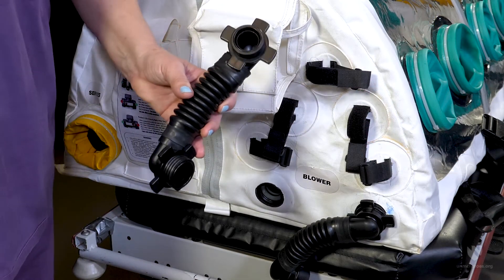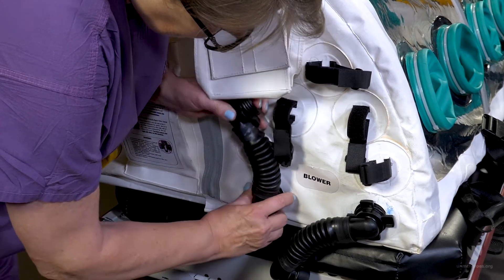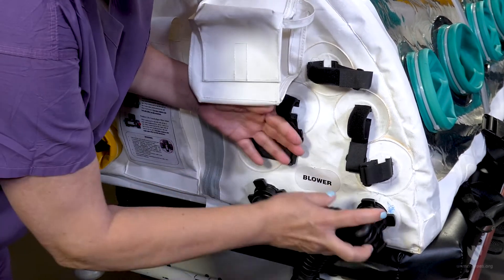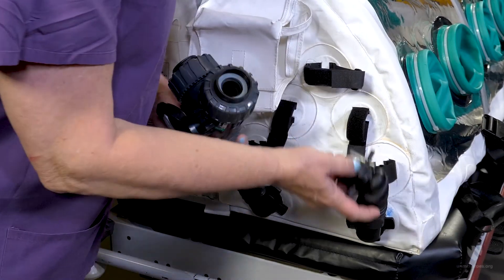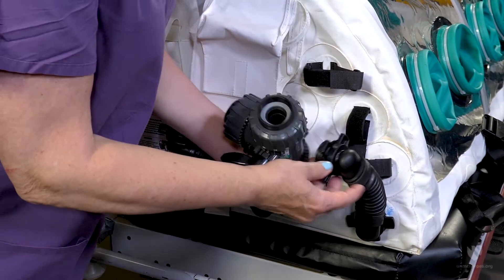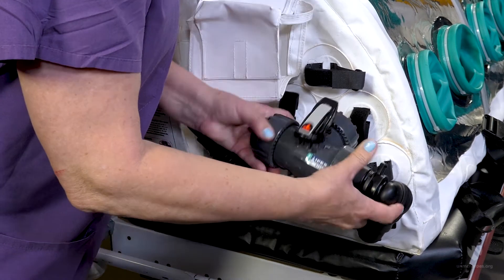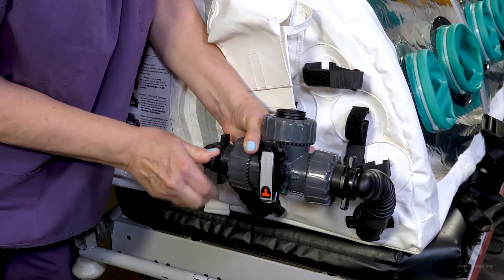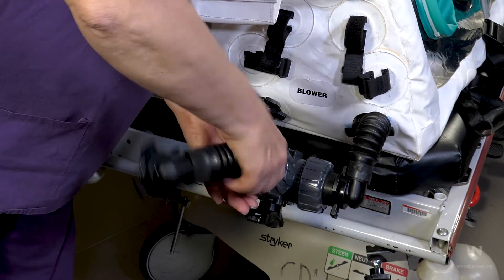Install the breathing hoses with two male fittings into the ports labeled blower, so that the unattached ends of the hoses have the openings facing each other. Thread the unattached tube ends into the three-way valve and hand tighten all the fittings.